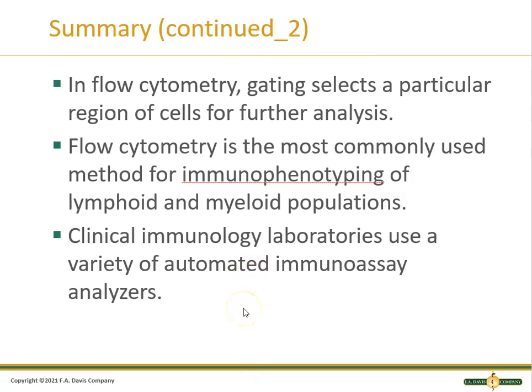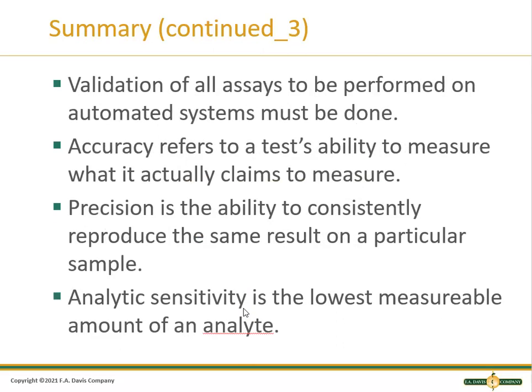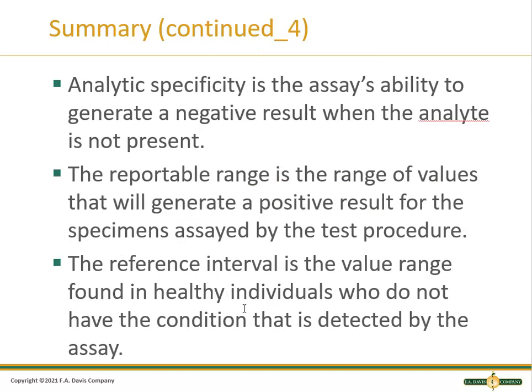Automated immunoassay analyzers, the validation: accuracy and precision, analytical sensitivity, specificity, the reportable range, in other words, it's also called linearity a lot of times, and the reference interval.